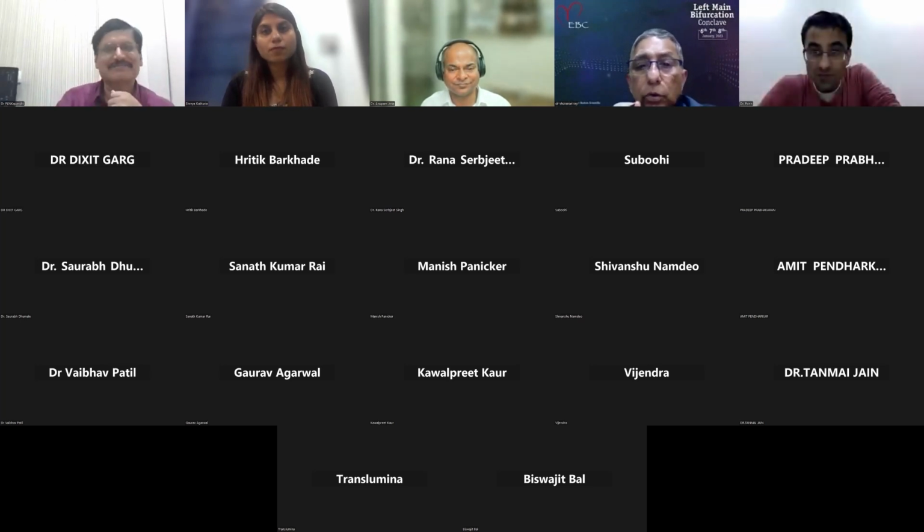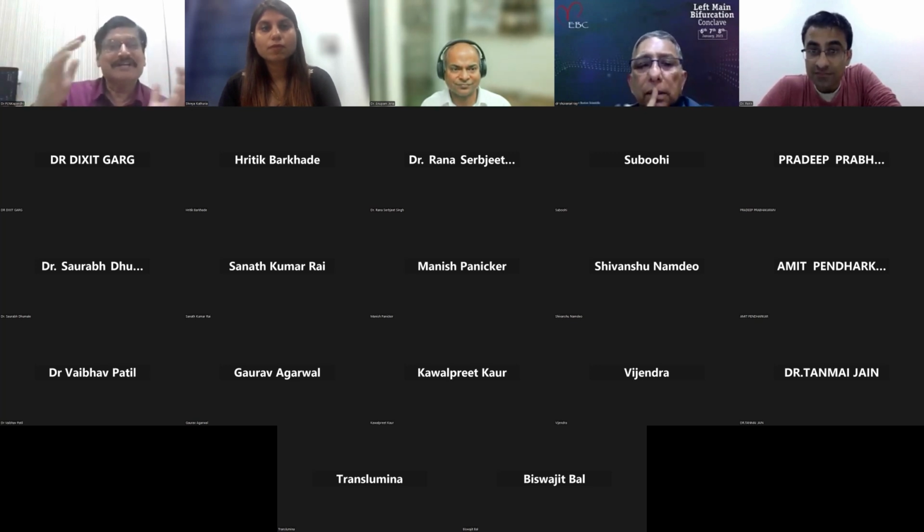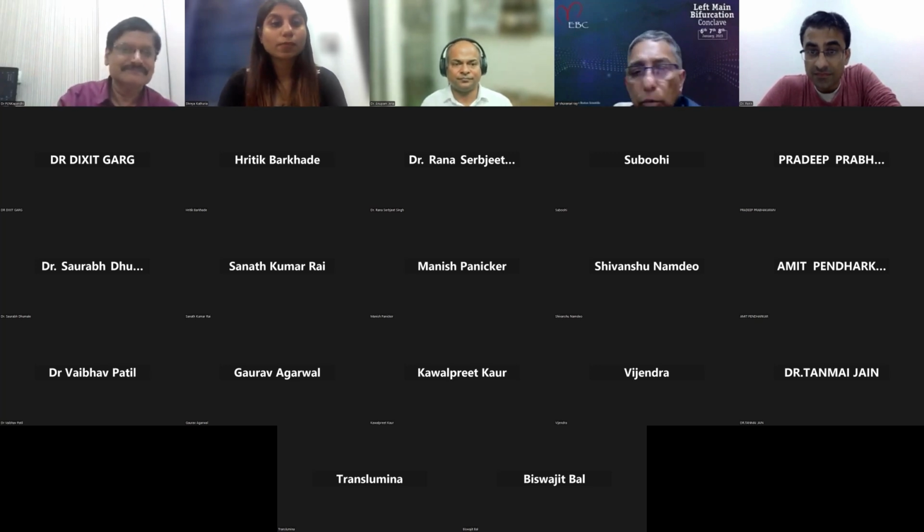You should not oversize the balloon. Yes, that is important. 1:1 means the EEL to EEL diameter should not be exceeded. If it exceeds the EEL to EEL diameter, the chance of perforation is high. Yes, that's it. So Shreya, good care.